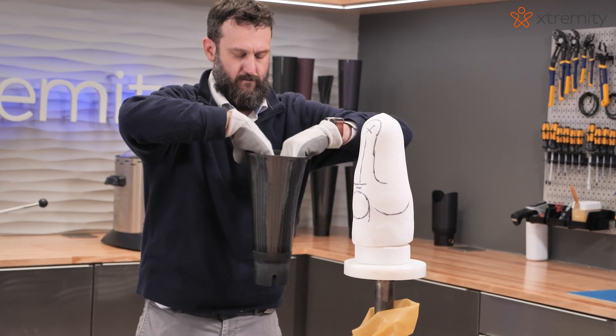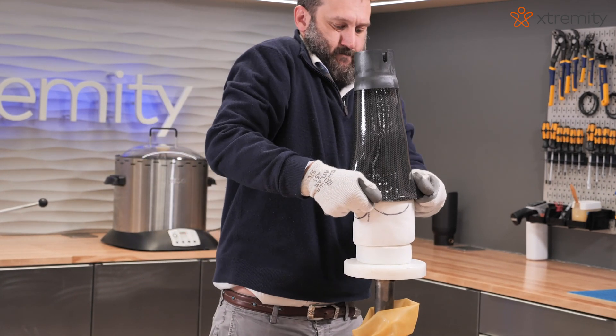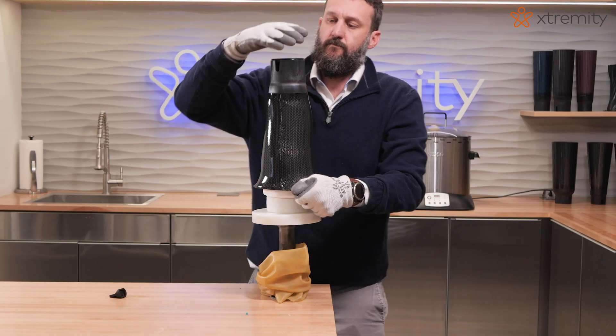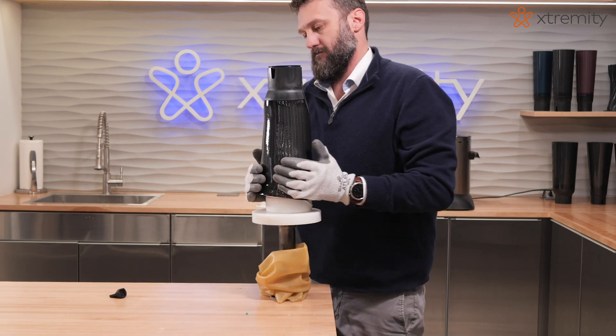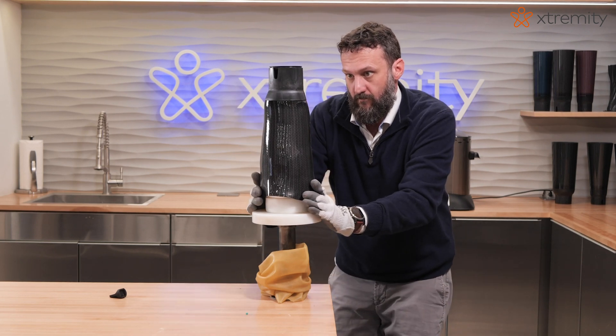Identify the posterior seam on the outside of the socket. Ensure correct socket rotational alignment using the posterior seam and the medial and lateral distal base cutouts. Use the base plate to push down from the distal end to prevent distal base distortion. Adjust base alignment if needed.